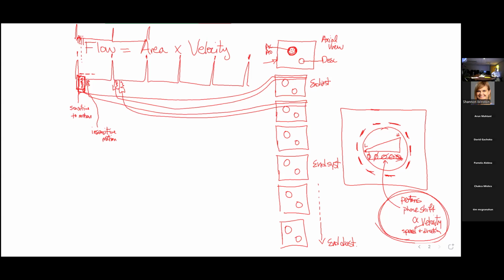Now, fortunately, we've gone to the scanner you have on North Ground, this 3T scanner, and not only is the overall magnetic field at 3 Tesla, but these gradient guys over here are really strong, right? And you can switch them really quickly. And so actually, the pair together, it's amazing, is only about 12 milliseconds in time. That's really fast, okay?